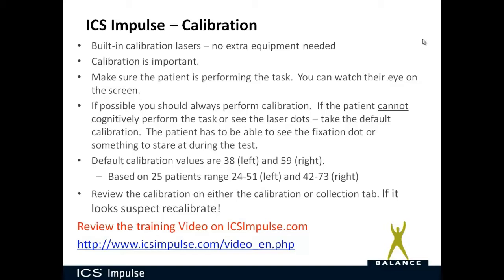Instead, what we've seen before with some facilities is the clinician asks the patient to look left and they don't realize they need to be looking at the left dot and they're looking far off to the left side. So you want to make sure your patient is performing the task appropriately. Always, always, always calibrate each individual patient.